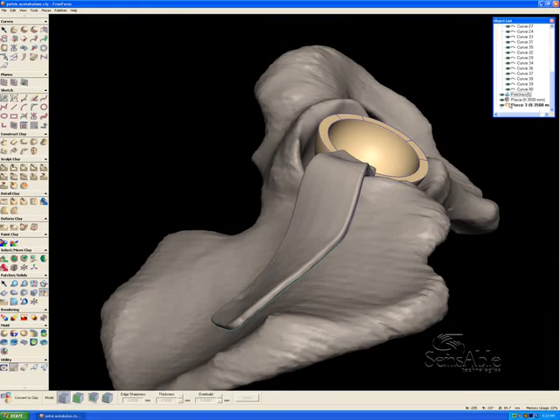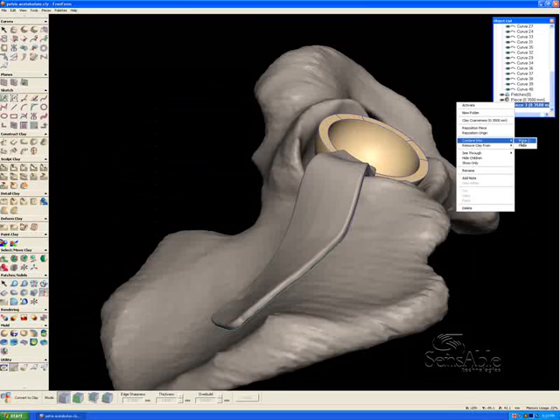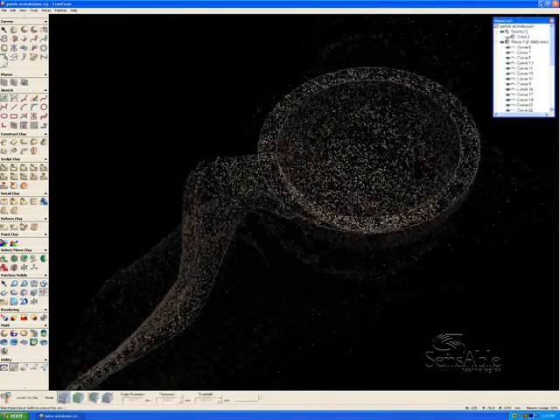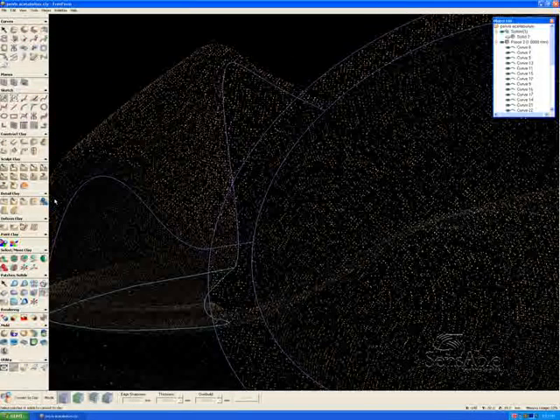The representation of it as clay here is this bottom piece 3 in the object list, and I'm going to say combine into this piece here, which is the tab that we just created. So I'm merging these two clay bodies into one, and let's zoom in here on the juncture, and you can see how they've started to mesh together.